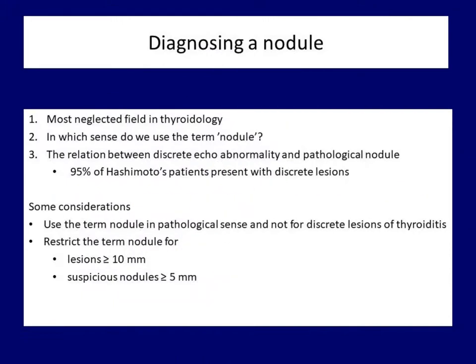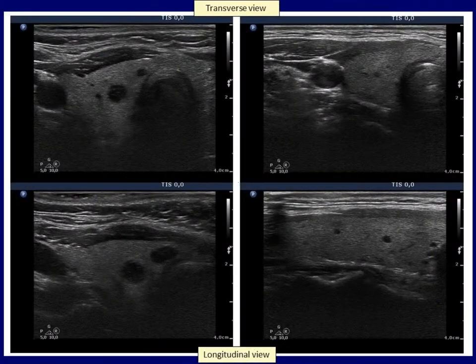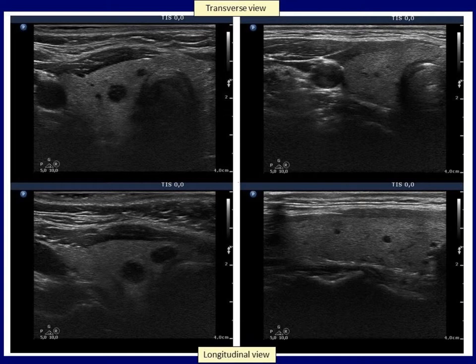Second, the use of 'nodule' should be restricted to those lesions which are larger than 10 mm in diameter, and for those between 5 and 10 mm which show at least one suspicious sign. Both patients presented with several discrete cystic lesions; however, these patterns should not be regarded as abnormal. If we use the term nodule for these small cystic areas, we stigmatize the patient and cause unnecessary anxiety. Such lesions are best named as discrete areas of non-pathological size.